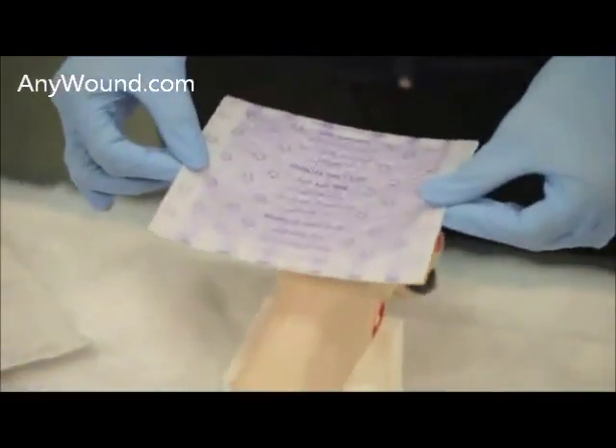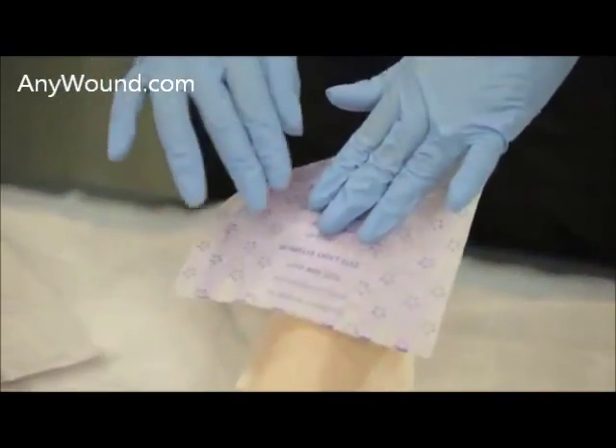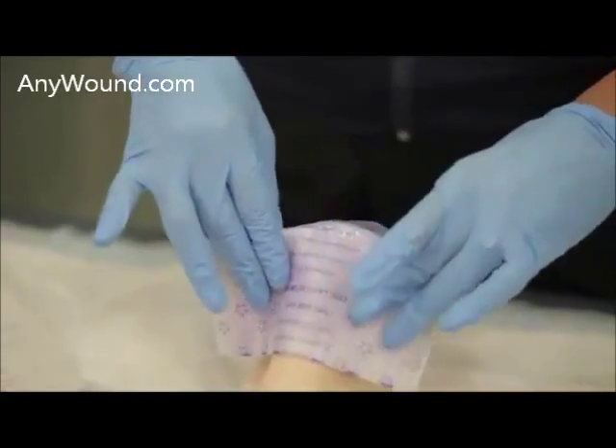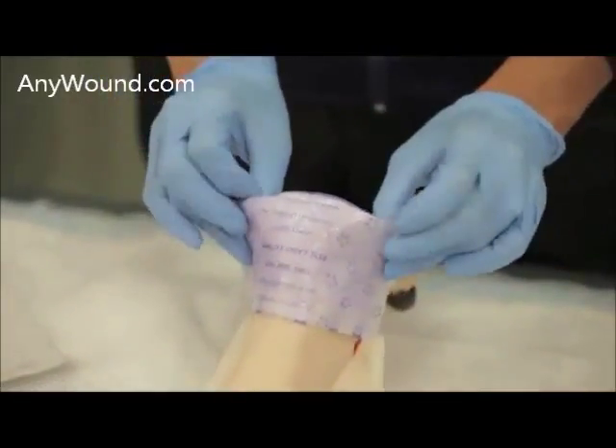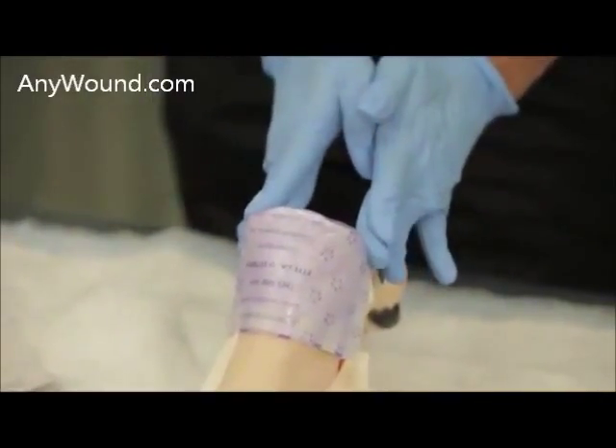This will be applied onto the wound and there are several ways you can secure this. You can either fold the dressing in this manner and then tape with it folded down.